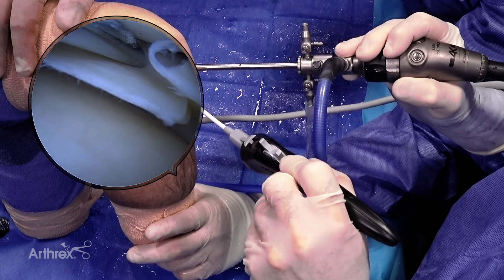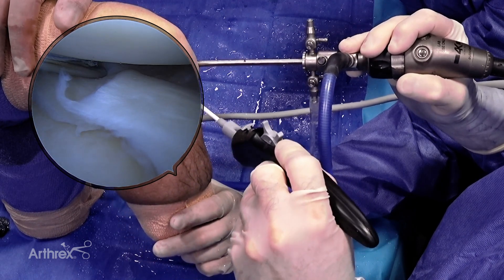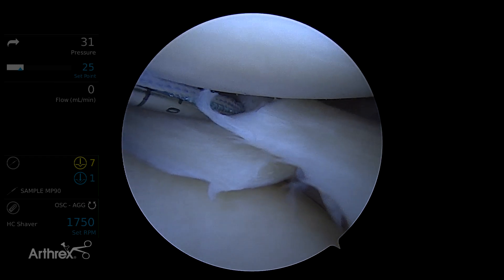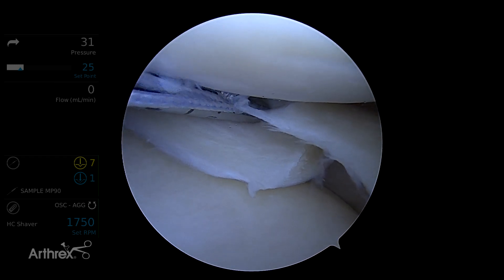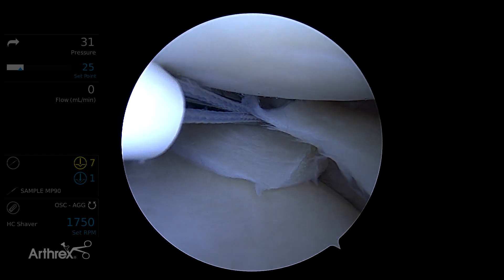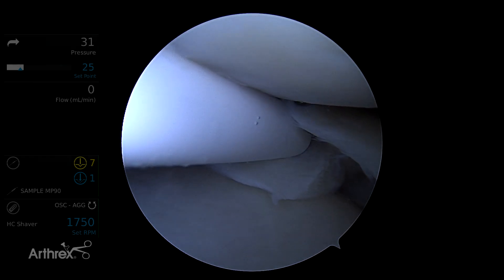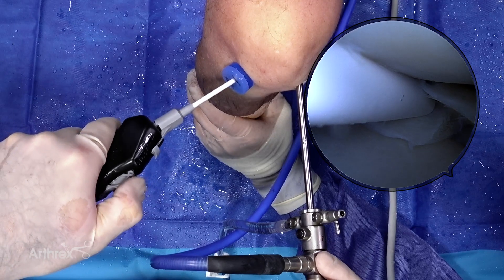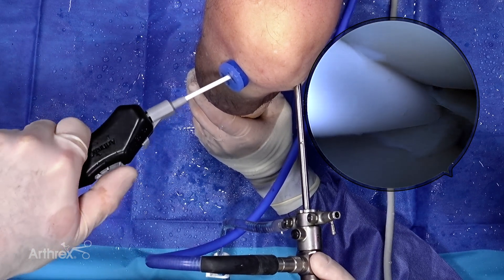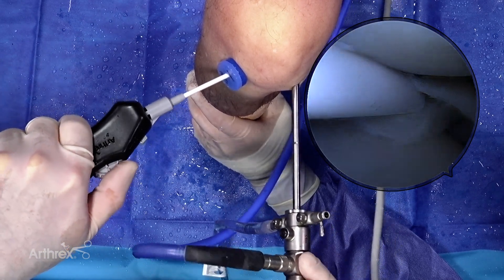I'm going to come in up high, up near the meniscocapsular junction. As I'm going through, if it were a mal-reduced one, I could actually translate here because this is actually going out the capsule too. So it just gives you something to reinforce against — the true idea of a ripstop. I roll back on the wagon wheel, then I roll forward until I hear a click. It's very palpable. There's the click.